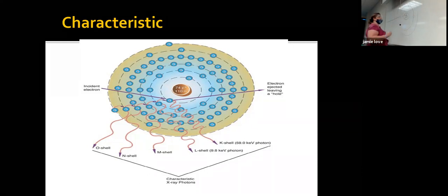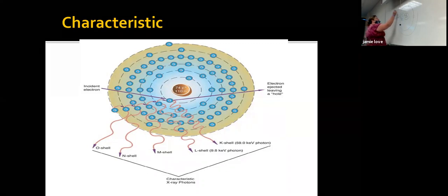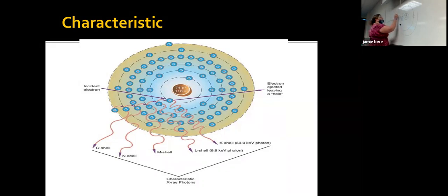And that says keV, kilo electron volts. So if we set our kVp, our peak kilovoltage, the energy level is measured in kilo electron volts of each photon or each electron that's coming across. So we need at least pretty close to almost exactly 69.5 or greater to have the energy to knock it out. So if I set kVp at 70, I can knock out a K shell electron.